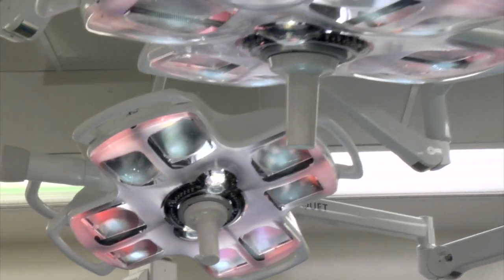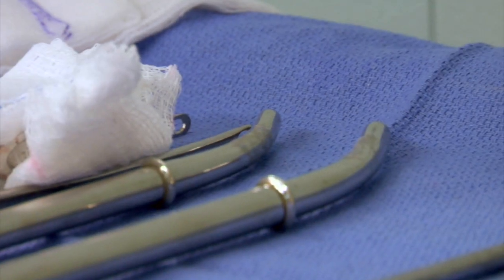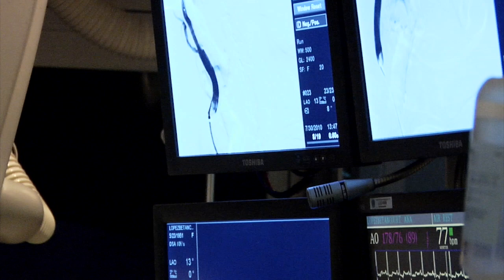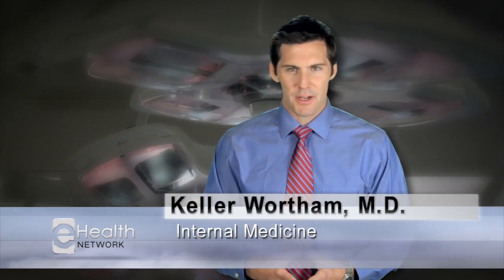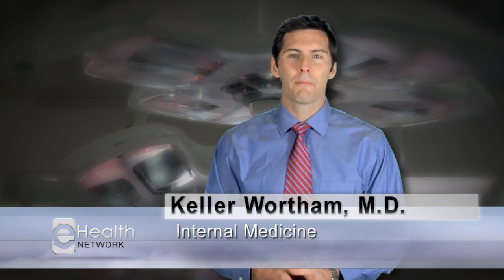The days of going under the knife are quickly becoming a thing of the past. They used to have to slice people open from stem to sternum, as they say. But nowadays, simple and really even complex surgeries are successfully conducted through incisions as small as 0.5 centimeter. In fact, the incisions are so small that the procedures are nicknamed keyhole surgeries or Band-Aid surgeries. But technically, we call them laparoscopic surgeries.